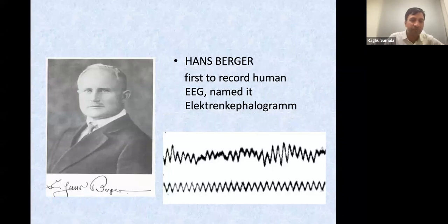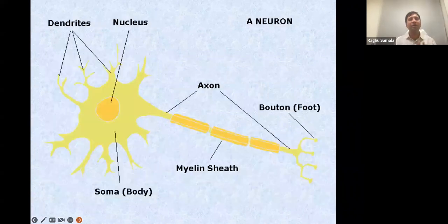In the first few minutes, we saw that there are waves coming from the brain and we name them based on the number of waves per second, either alpha, theta, or delta. Those are the normal ones. And we saw the spike and sharp waves, which are transient and clearly distinguished from the background. So now we have a mental picture of what the output coming from the EEG actually is.